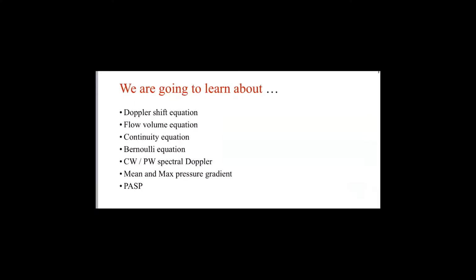What we are going to learn here in this quick session is the Doppler shift equation, how we calculate the volume, continuity equation, Bernoulli equation, CW, PW, max and mean pressure gradient. And if we have time, we're gonna talk about pulmonary artery systolic pressure. Of course, all these things are more or less familiar by now. We are just going to consolidate it in a way or another.